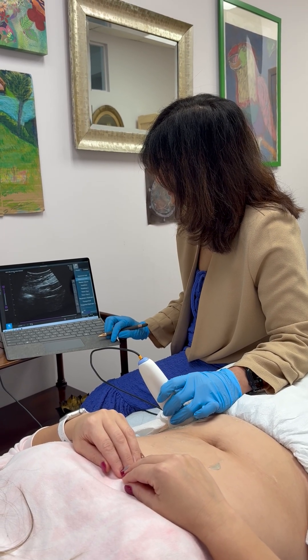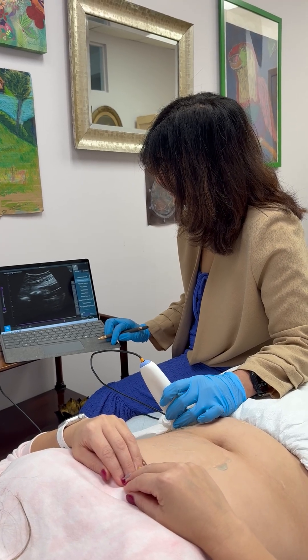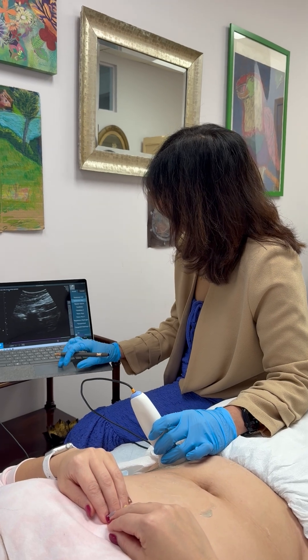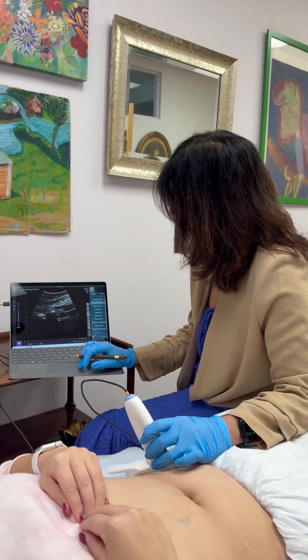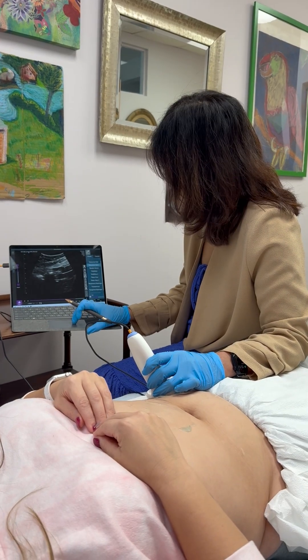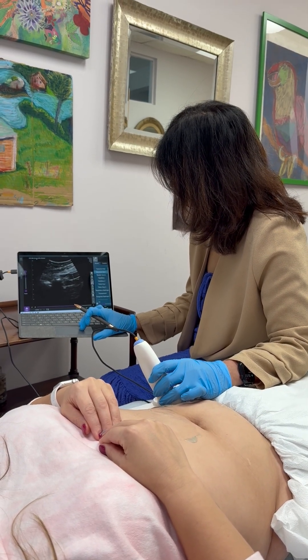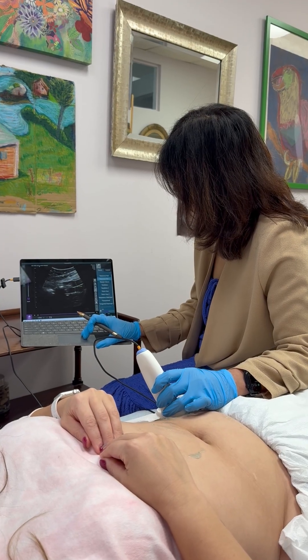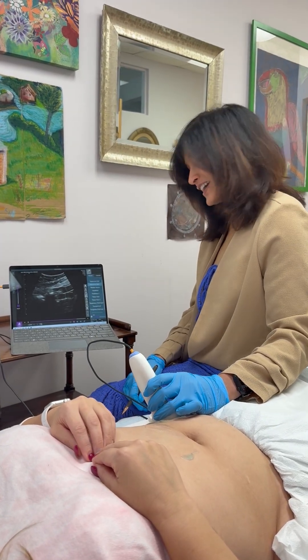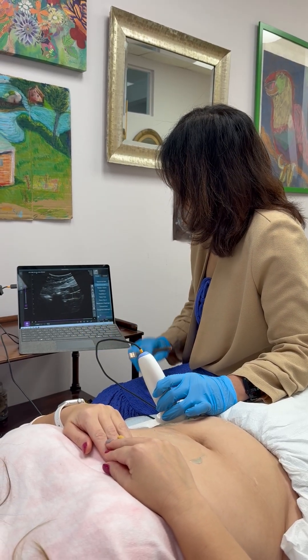That got better. So let's do that again — do a little fogging. Good, and again. Now if you measure this, you can see we got a little more thickness there. The muscle is there, it's working — we have measurements of 11 and 8.5. Impressive! It's there, we just have to work it.